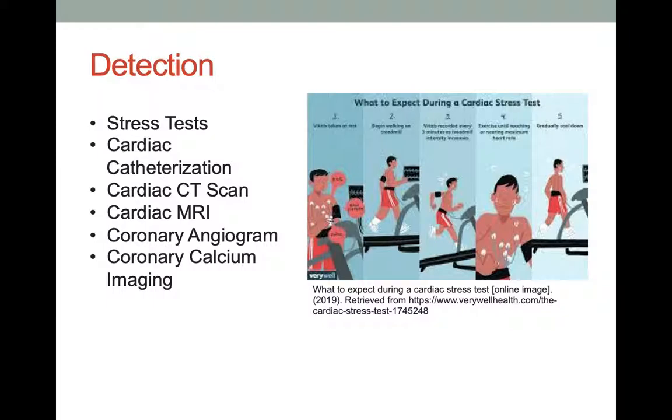As we're looking at that, the more calcium that's there gives us information about what's going on. Obviously, the more calcium, the more potential blockage there is. And then it measures both the amount of plaque present as well as the stability of that plaque, where it's at. Is it free floating, which could be bad. Interesting how we could do it. It's a rather inexpensive test compared to some of the other ones. So interesting to see how this plays out in the future.